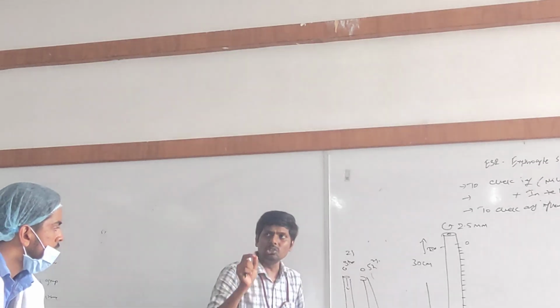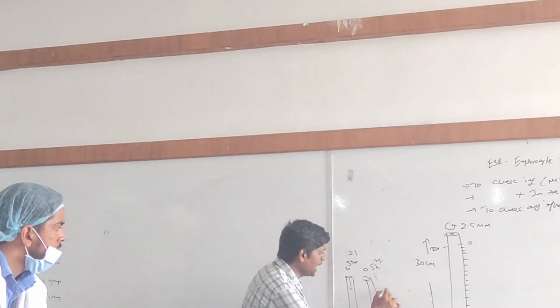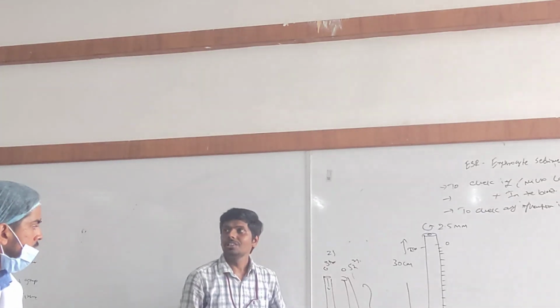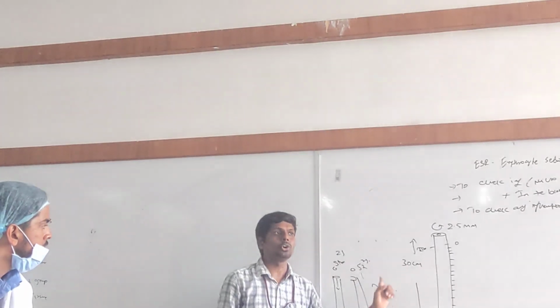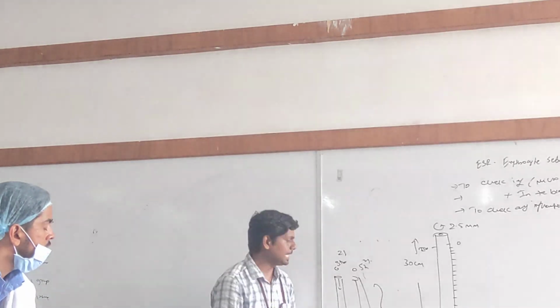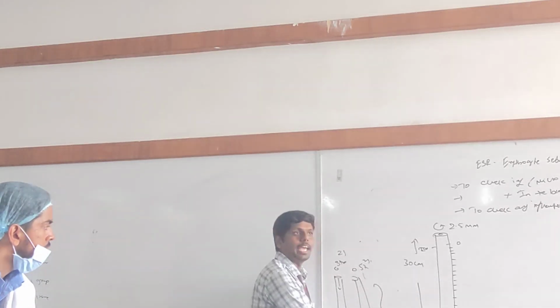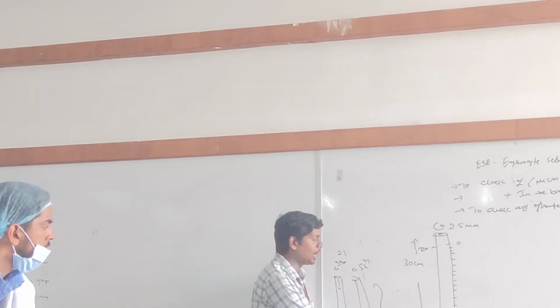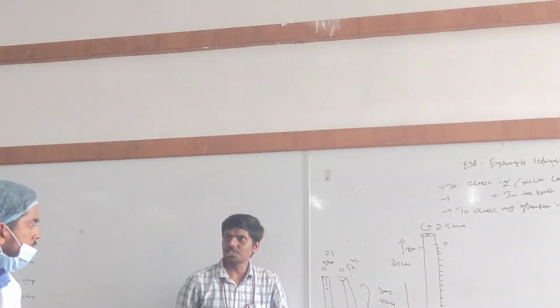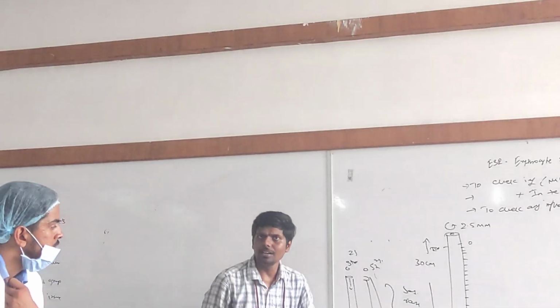Now we are going to study the time it is taking to sediment. The time it takes for a stone to settle at the bottom, that rate is called the sedimentation rate. Time and its length of travel is called rate. Here we are studying the sedimentation rate, right?